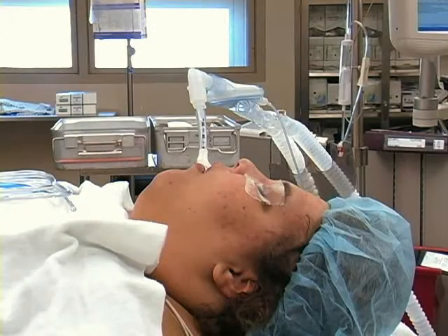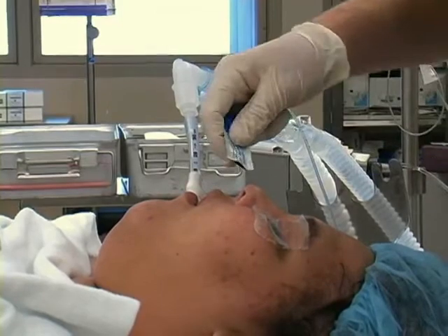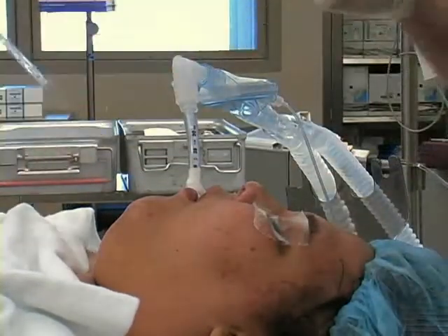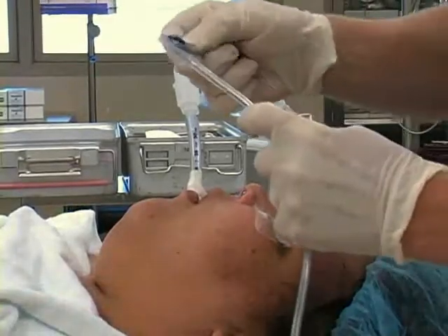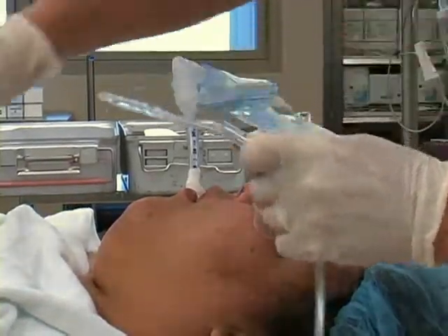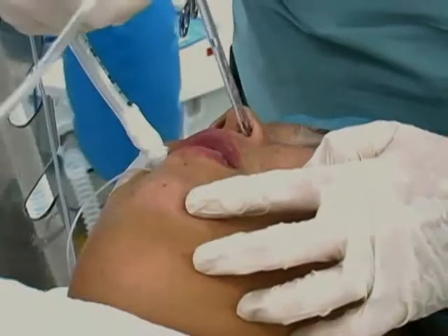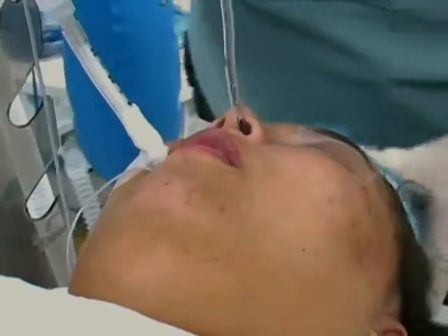After general anesthesia has been induced, place the patient's head in neutral position. Lubricate the naris through which you will insert the NG tube. Generously lubricate the nasogastric tube with Surgilube. Place the tip of the tube into the patient's naris.